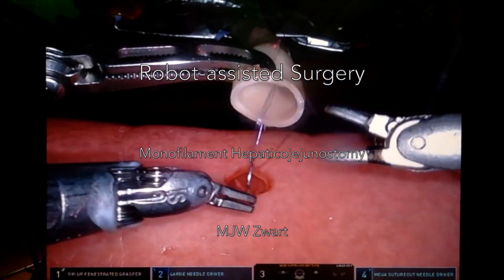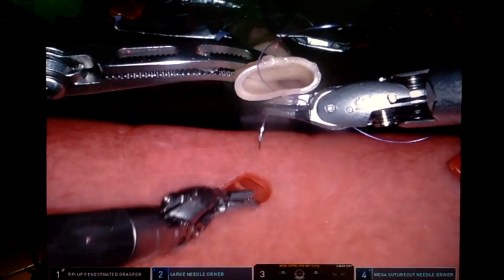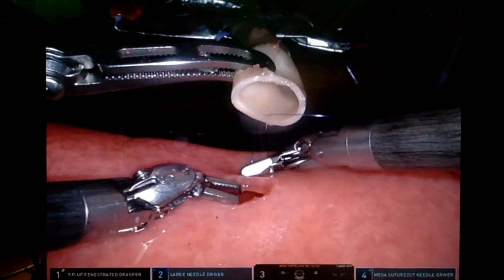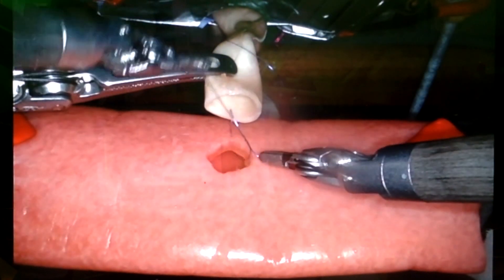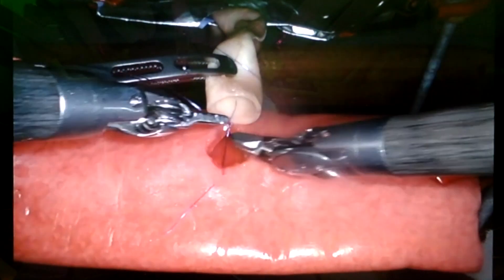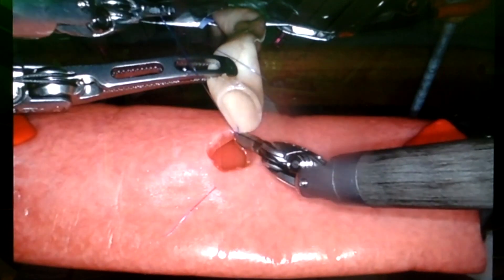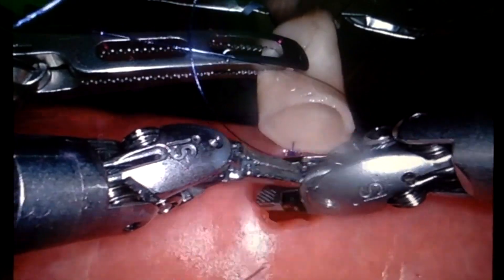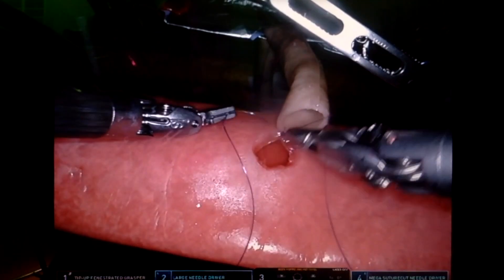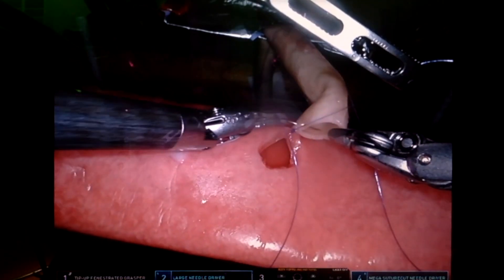Hi there, this is the running style hepaticojejunostomy. Most surgeons use a V-lock, a barb suture, for the hepaticojejunostomy with the robot. But in a brittle bile duct, the barbs can actually damage the bile duct. The alternative is a running suture with a regular monofilament. This is how we do it.